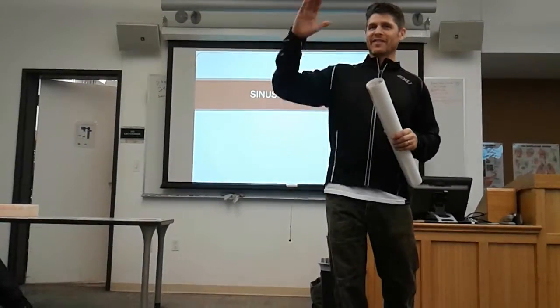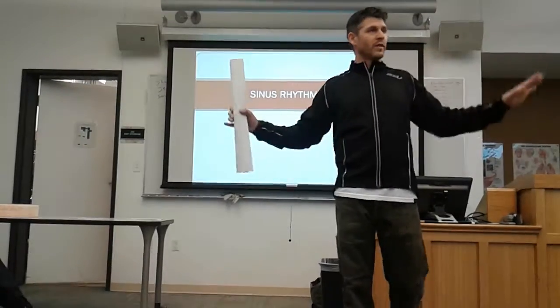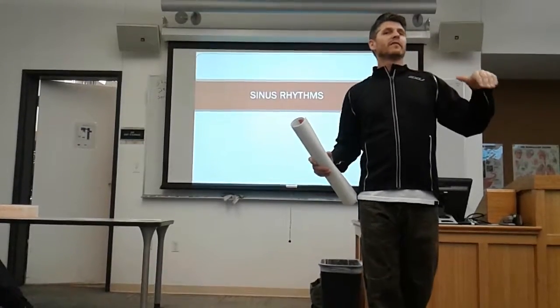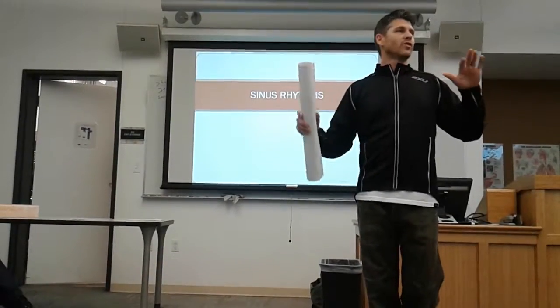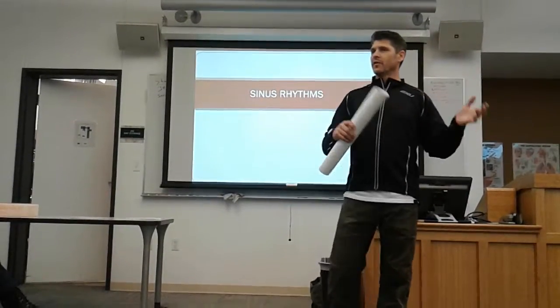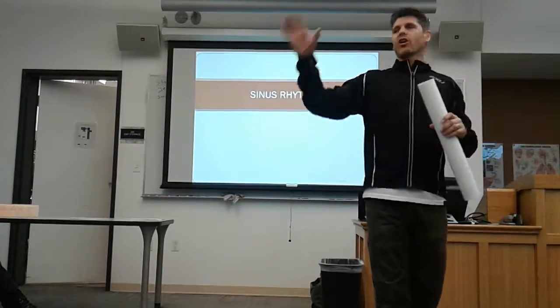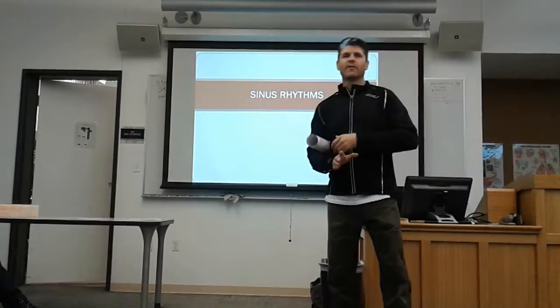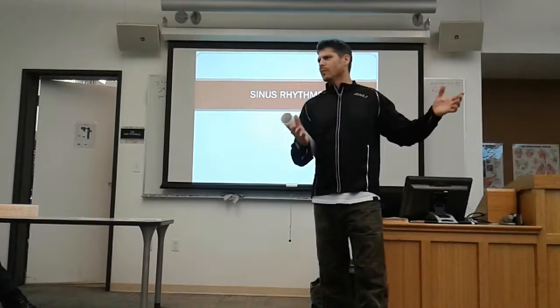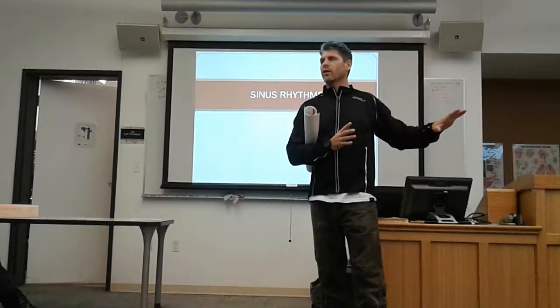To get to everything that we needed on a normal sinus rhythm is what you're being asked to do on all rhythms, right? That's how you're being asked to approach all rhythms. That being said, we need to start looking at comparisons of different rhythms to see what is different from a normal sinus rhythm. And much like I would prefer that you take all the cardiac-related conditions and find out what are all the common signs and symptoms amongst all those and throw them out. I mean, learn them, but that just tells you it's cardiac. That doesn't tell you what cardiac problem it is.